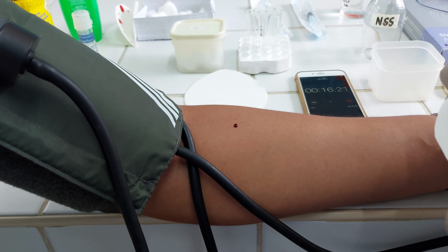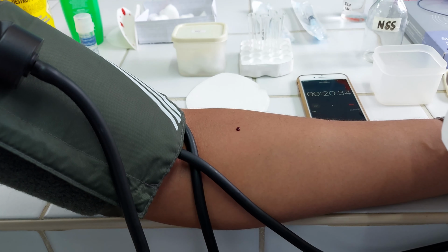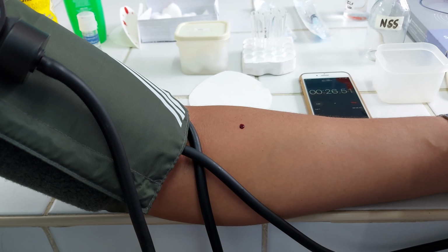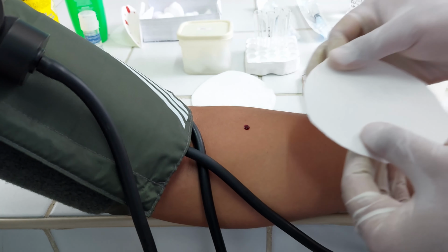skin. Push the trigger and start the stopwatch at the same time, and the Surgicutt produces a standard wound of 5 mm long by 1 mm deep. Remove the surgical device from the forearm immediately after making the incision.